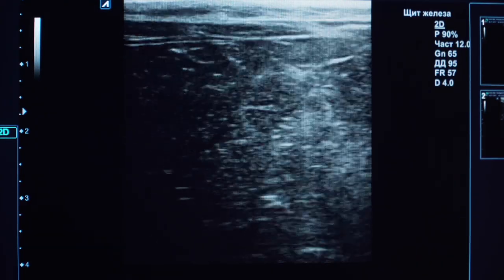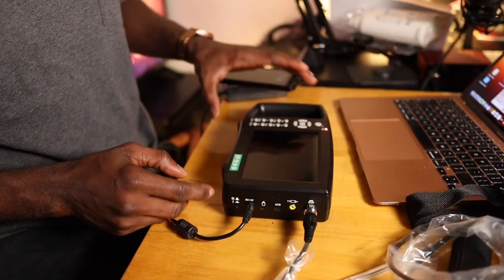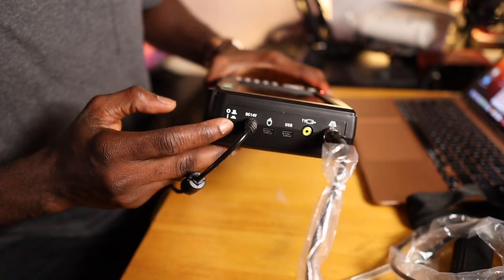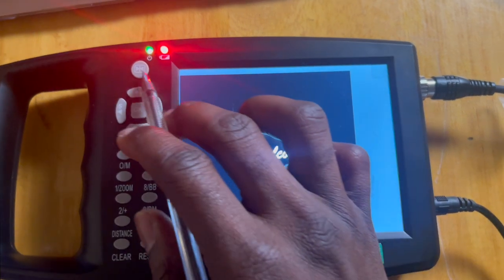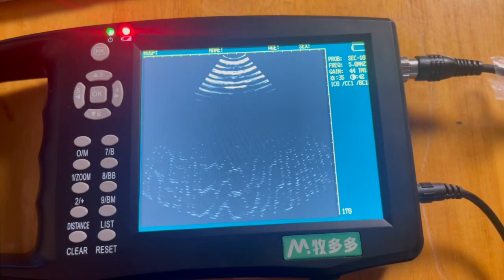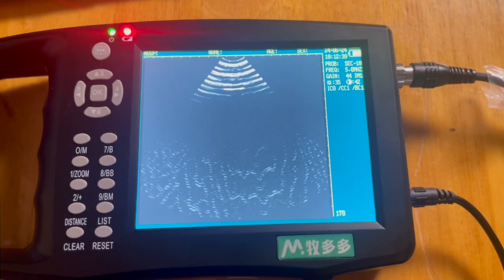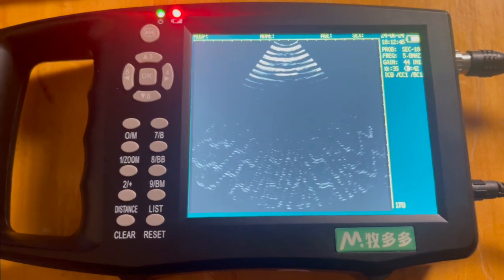This device works by using high-frequency sound waves to create real-time images of the internal structures of your animal. You switch on the power, the indicator on the panel turns on, the startup screen appears, and you press any button except freeze and reset to enter scanning mode. You can adjust the brightness and contrast for better visual effect. We will mostly use it to determine pregnancy by examining the uterus to confirm pregnancy, assess fetal development, and estimate the size of the litter.